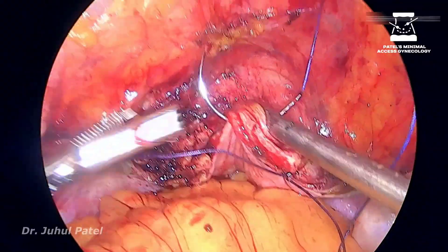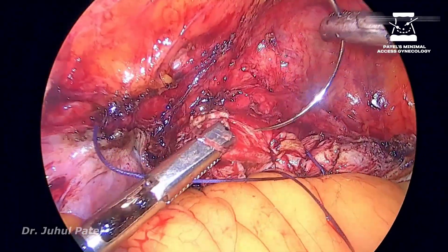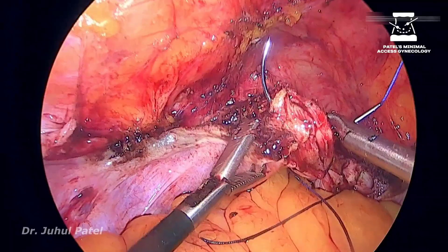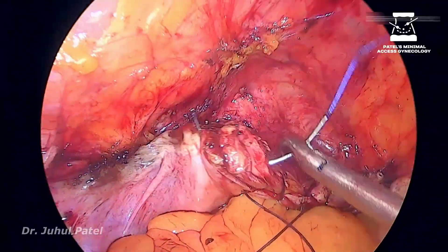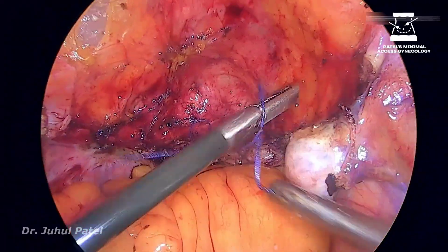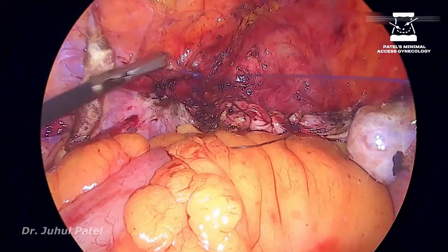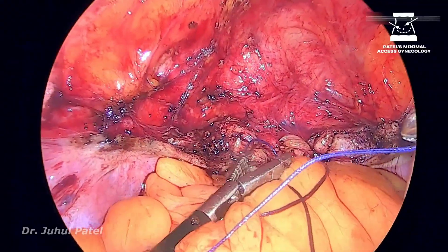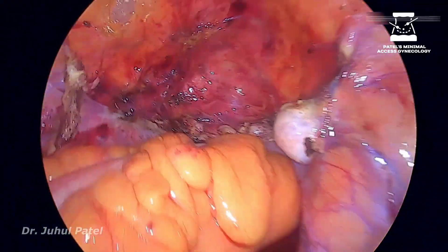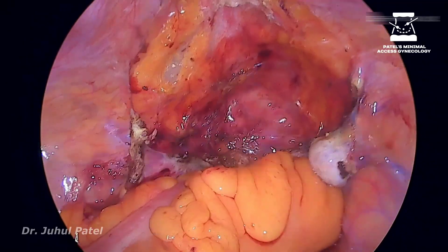This is contralateral suturing. As I always tell my fellows, whenever you are learning, learn the contralateral first because it is always easier than ipsilateral to replicate. While you do contralateral, always practice for ipsilateral as well, because in cases of myomectomy you need to have both types of skills. Finishing up with the vault closure, and I think that was a good case to discuss.